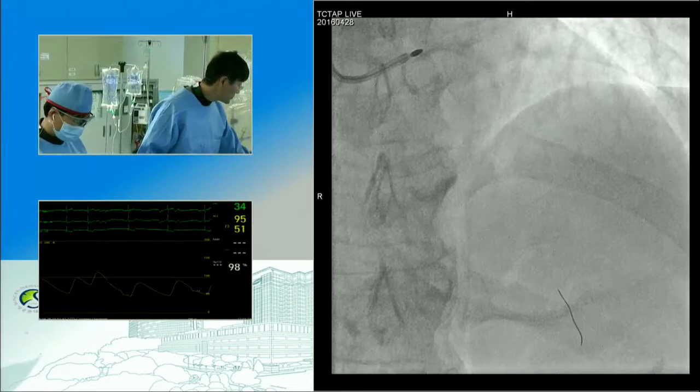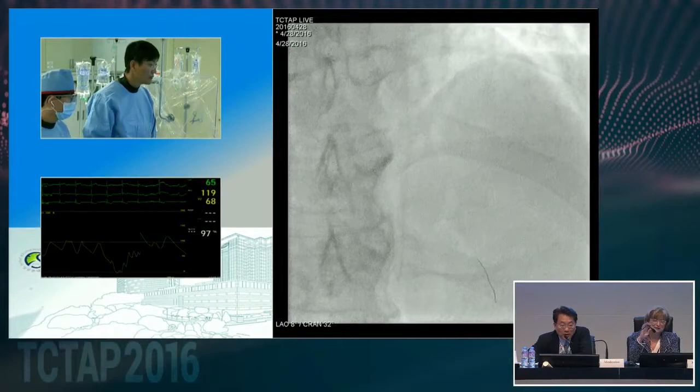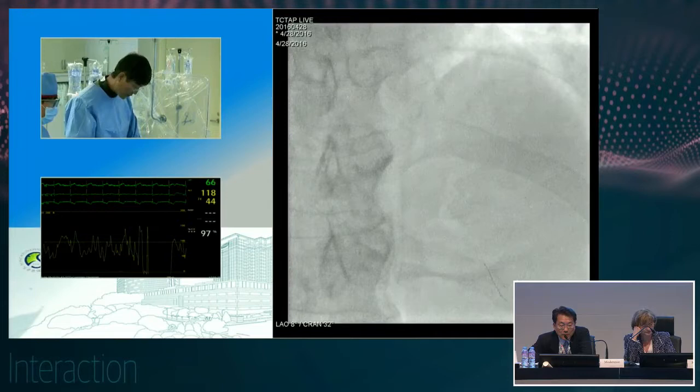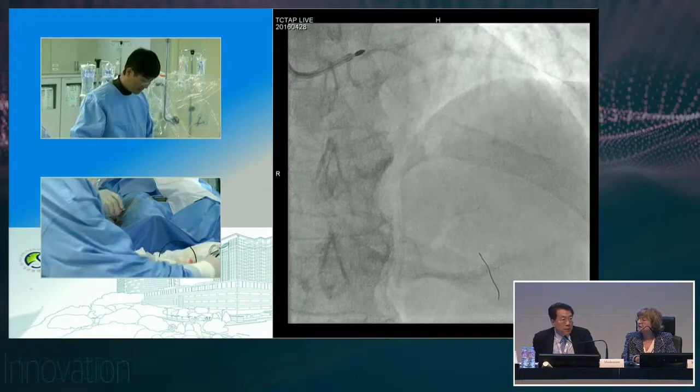Okay. Getting a bigger burr. Anyway, the distal emboli is showering. High risk of it. Right, so be careful about it. It's time to stop. All right. More things about the procedure, you don't like it, so smooth, right? I'm showing there's some trouble. And another issue is that we can make some periprocedural CK enzyme elevation. CK, right. So let me check whether there is a slow flow or not.